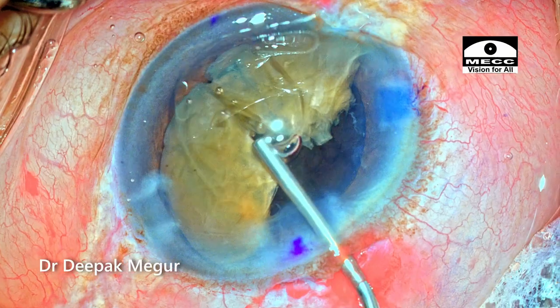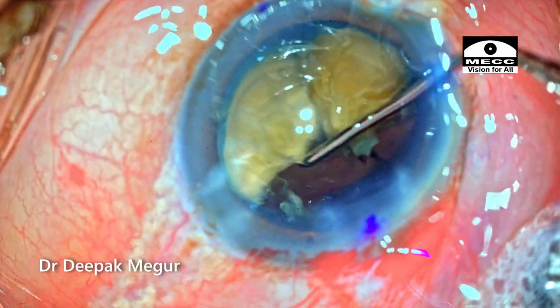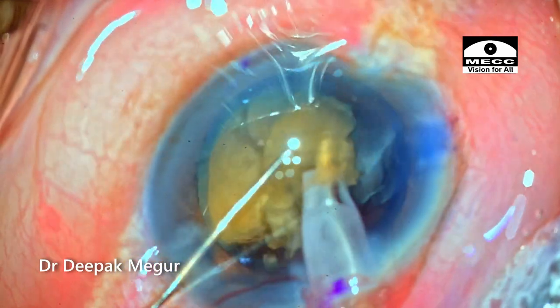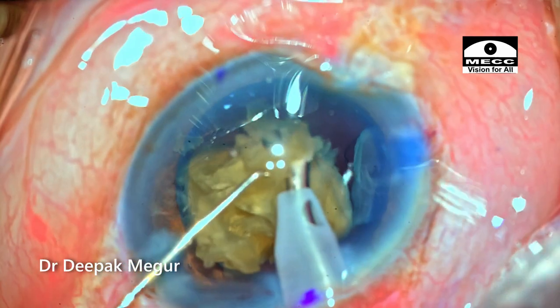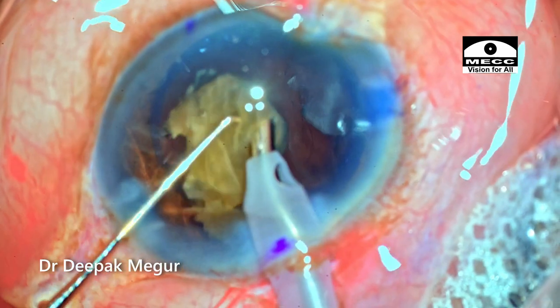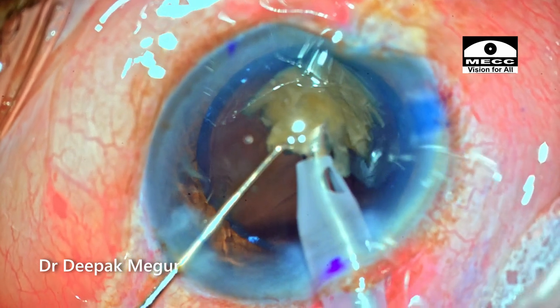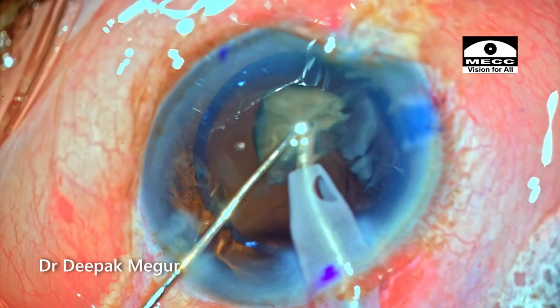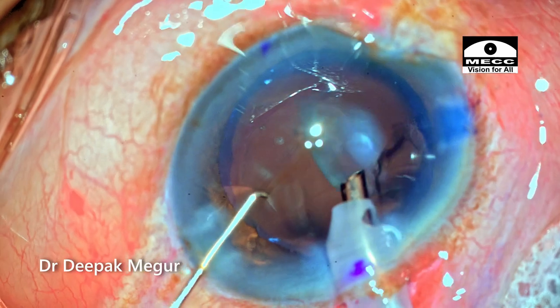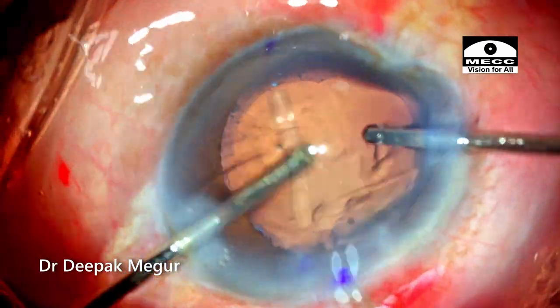Since the heminucleus has popped out of the bag, I push it back into the bag so that emulsification is done away from the cornea. The first of the two last fragments is emulsified. Finally the last fragment is emulsified very slowly and in a controlled manner, as it has come up above the iris plane. I need to be mindful that excessive turbulence does not damage the endothelium. The cortex is aspirated and the intraocular lens is placed into the bag.